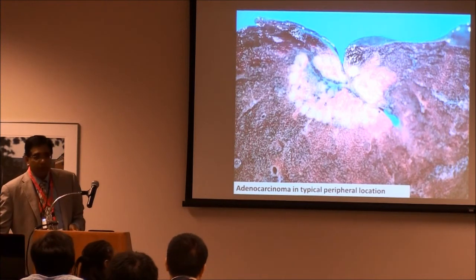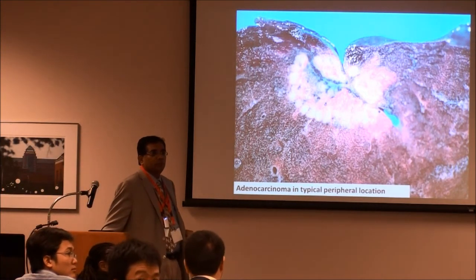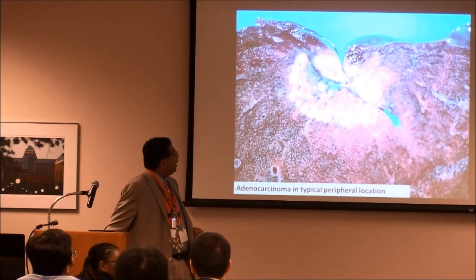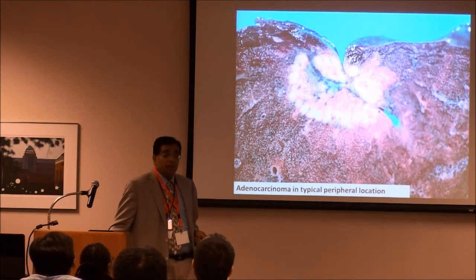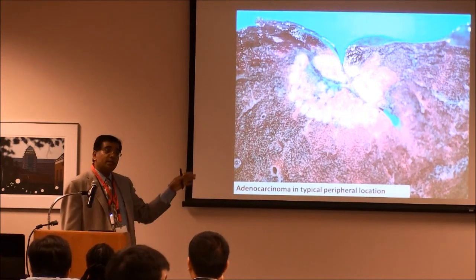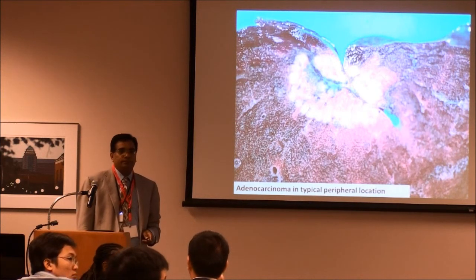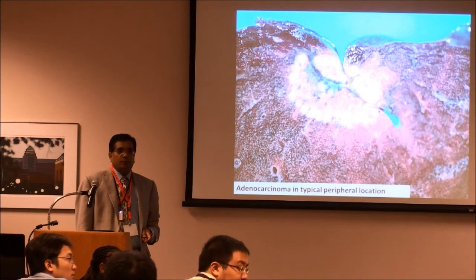Is that lung black because of the cancer, or is it black because of smoking? It is not because of cancer, no. It's because of something that happened to the lung. It's called anthracotic pigment. Smoking does make the lungs black though. When you're looking at the tissue sample, how much do you know about the patient before you make the diagnosis?